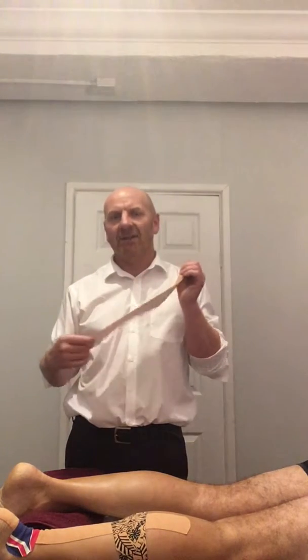What we're going to do is tape using what's called dynamic tape, which has got this Maori print on it. The difference between this tape and K-tape, which is the traditional tape that everyone uses, is this is multi-directional and it also has a massive recoil, whereas K-tape has an end range, whereas this doesn't.